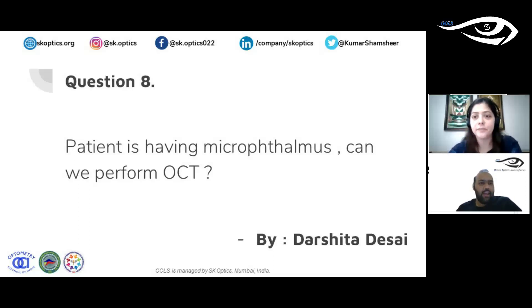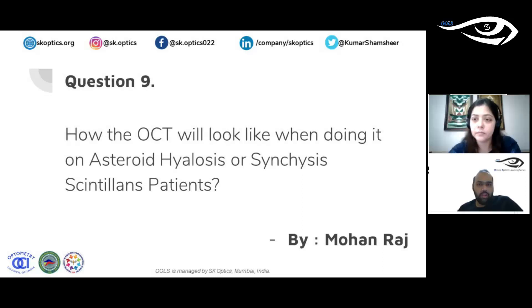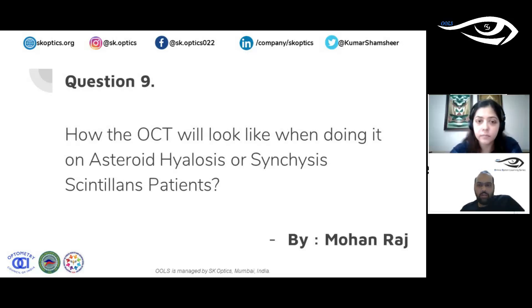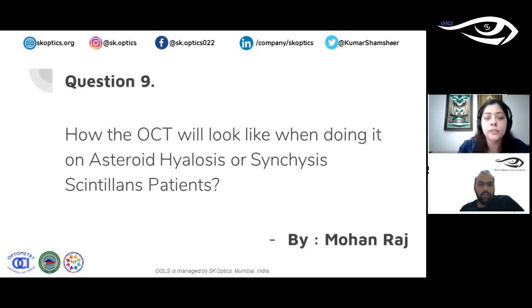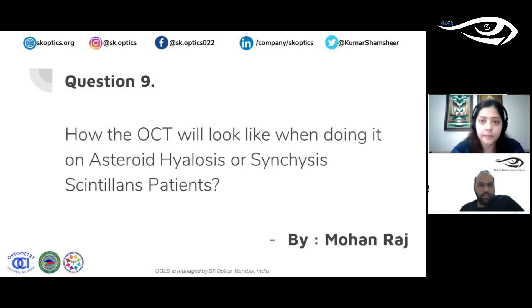Regarding OCT appearance in asteroid hyalosis: normally the vitreous appears clear and black on OCT, but in asteroid hyalosis you will see hyper-reflective spots moving around in the vitreous. Depending on how dense the asteroid hyalosis is, the normally clear vitreous will show these reflective spots. This is similar to floaters, which may show one or two such spots, but in asteroid hyalosis there are many more.